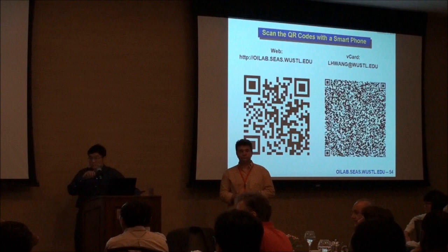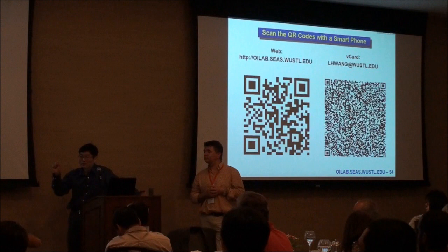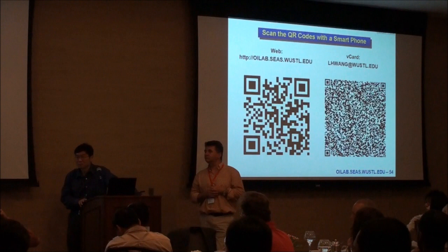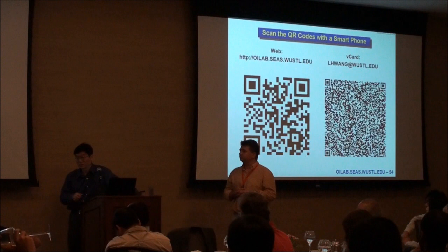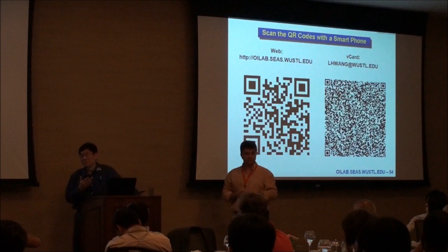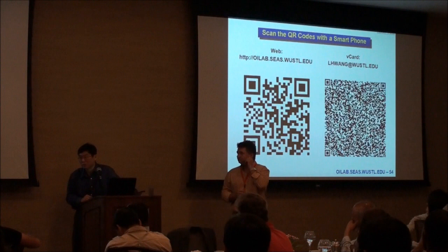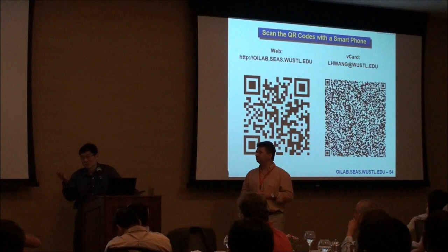With your oxygen saturation, what's your time scale for the scan that you showed? It's getting faster and faster. That single cell movie was at 20 frames per second, and I could push that to 80 frames per second. So you can make it really fast. Intrinsically, your ultimate speed is limited by acoustic arrival time. The speed of sound is 1500 meters per second. Within a millisecond, you propagate 1.5 meters. So if you're only using 1.5 millimeters, 1 microsecond is all you need. It's very fast.